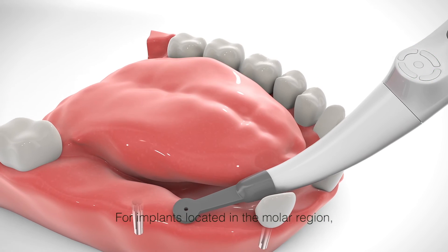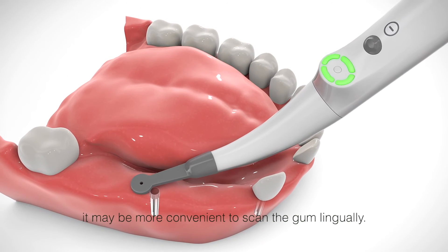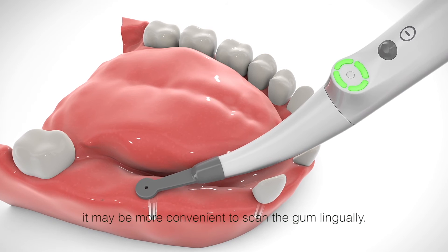For implants located in the molar region, it may be more convenient to scan the gum lingually.